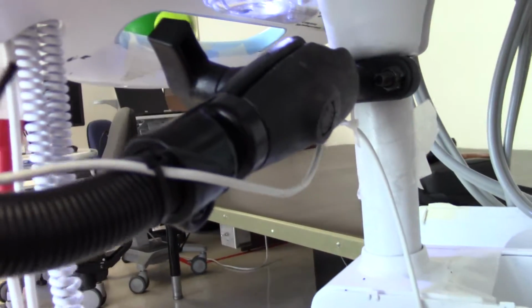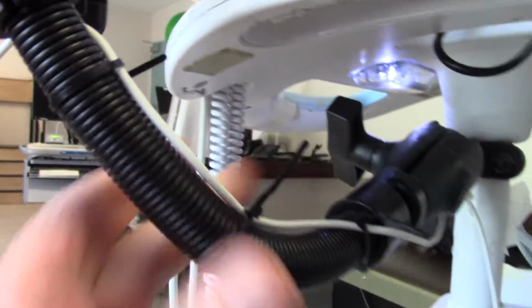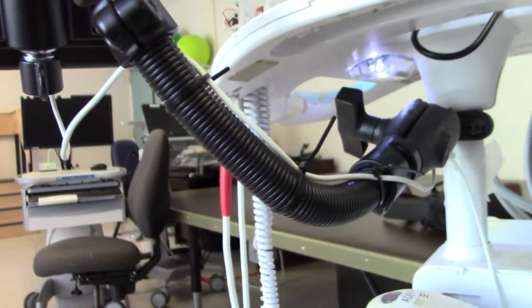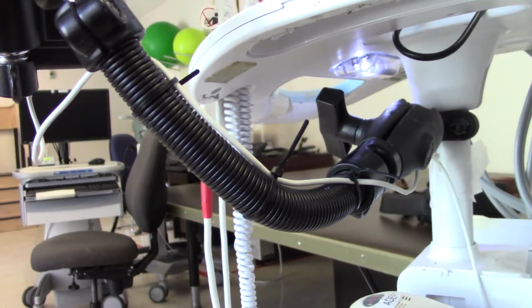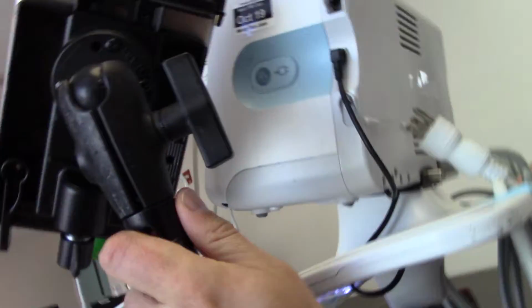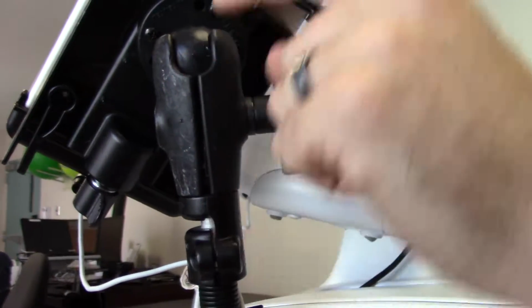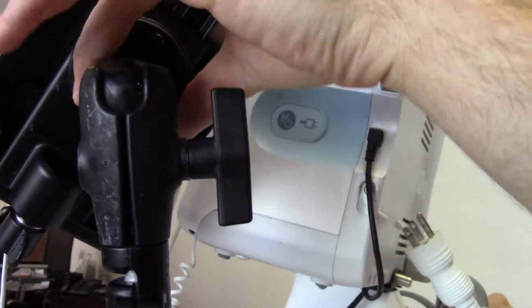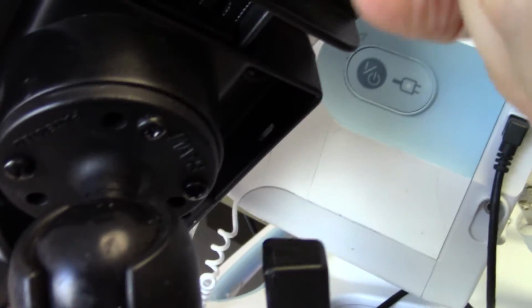Oh, and here it is. Correct, and then it just gets sleeved there. It's kind of like EMT. It's solid aluminum, solid, soft aluminum. So it's some kind of alloy. It's just aluminum, whatever grade of aluminum, annealed or whatever, so it's pretty soft. Then you've got another shoulder joint up here. Correct, a ball joint. So this ball joint here is a discrete unit that you have to purchase separately that then goes onto the back of the iPad mount.